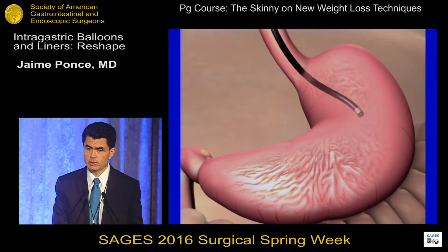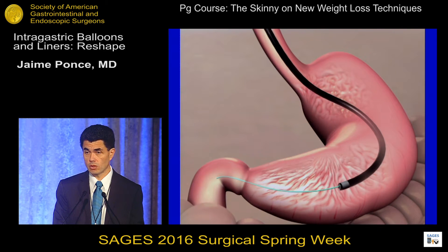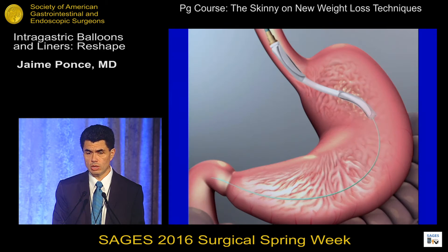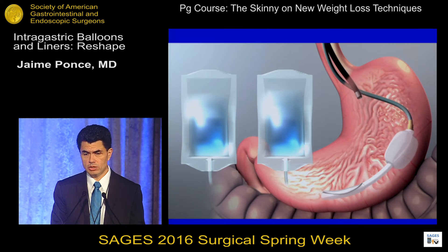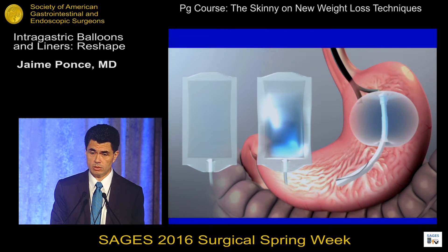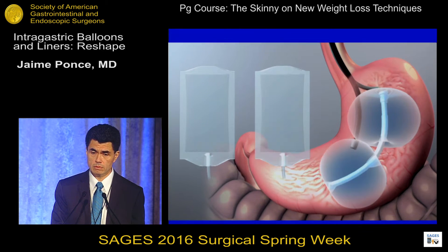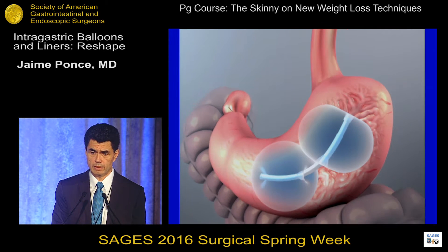The placement of this balloon is done endoscopically. We put the scope in and verify the stomach is okay — no ulcers, no significant hiatal hernia. We slide a wire down to the first portion of the duodenum, and through the wire we slide the catheter with the two balloons. They lay down in the greater curvature, and under direct visualization we inflate one balloon and then the other using a special pump that allows quick inflation. The attachment from the introducer is then removed.